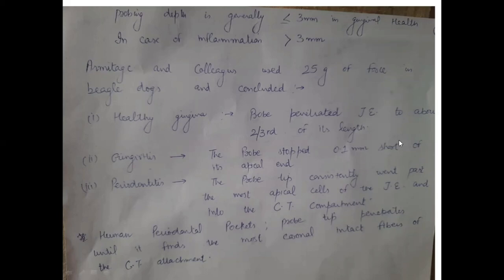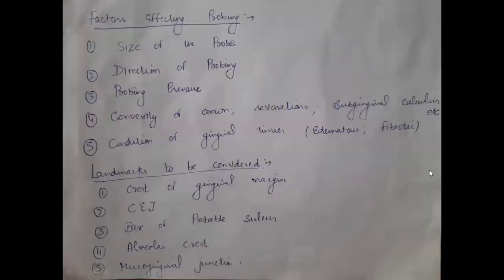Now, what are the factors which affect the probing? In probing, the most important factors are size of the probe, probing force which is being used, and direction of probing. Now, what should be the size of the probe? It is very common that if there is a thick probe tip, then it will not go into the deeper pockets which are narrower. So the size of the probe should be standardized. In normal cases, a probe of less than 1 millimeter size is standardized and used.